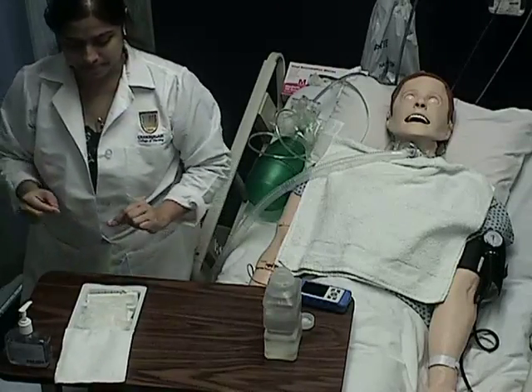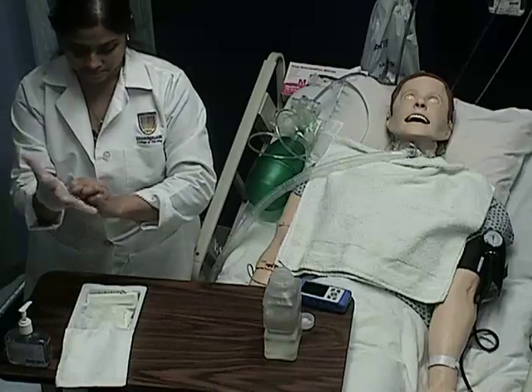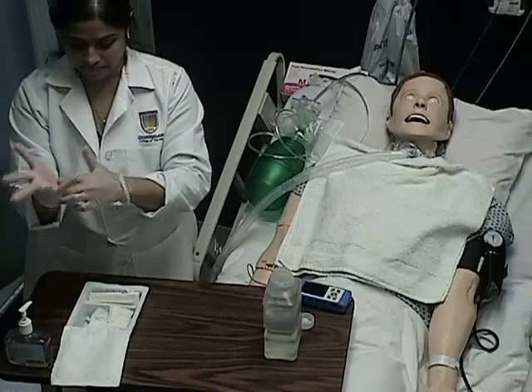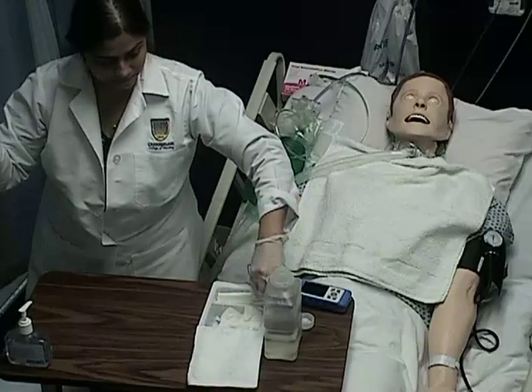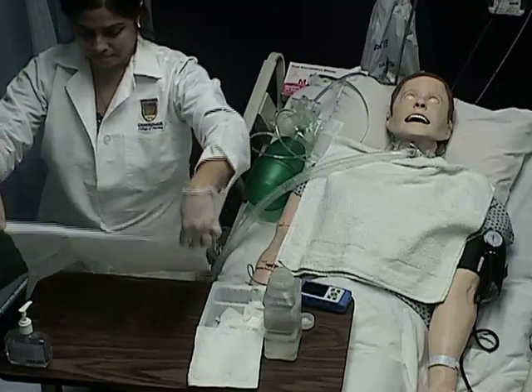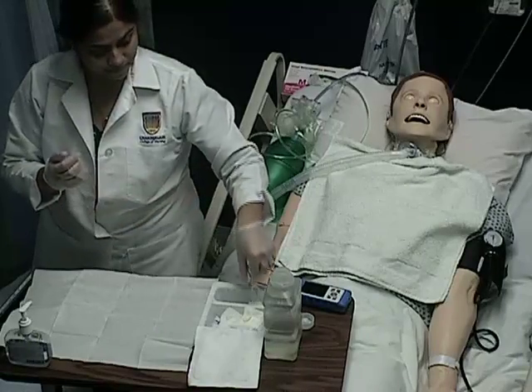Please put on your sterile gloves. Next, remove the sterile drape and place it on the bedside table without contaminating it. After doing so, retrieve your supplies from the sterile trach kit and place it on the sterile drape.